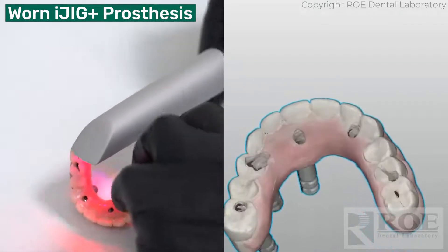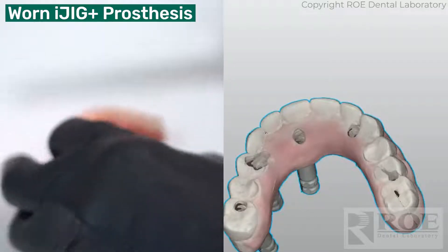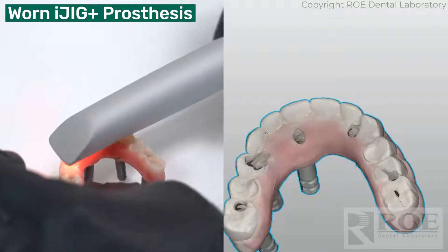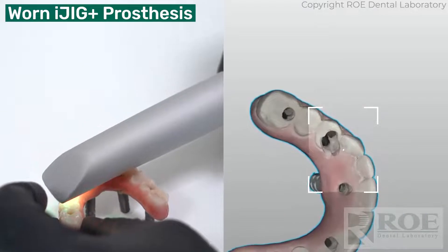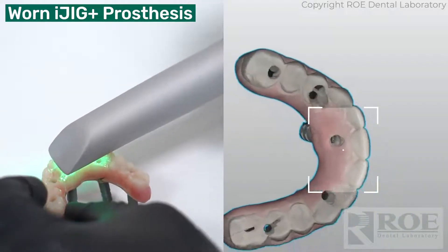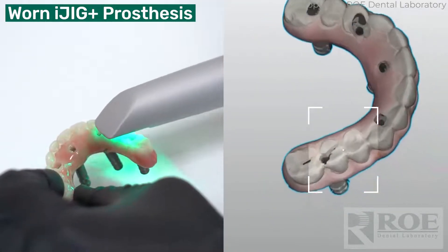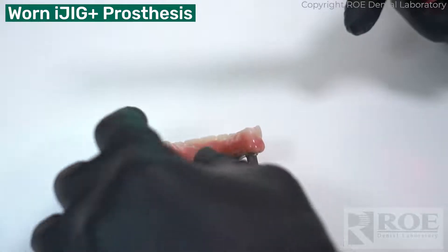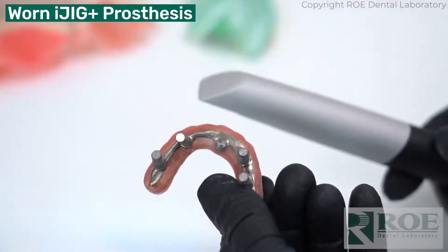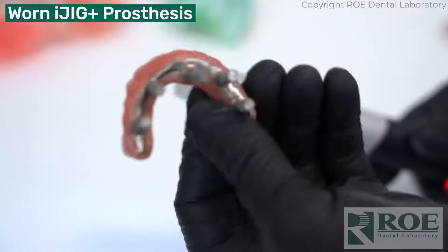I'm going to set it down so it's stable. I'm just going to do a little bit more of the occlusion to get these holes — down in the holes there. Probably don't need to do it, but I'm going to do it anyway. So that's about a three-minute scan for an iJig — a really nice, successful scan of an existing prosthesis to make a new one.